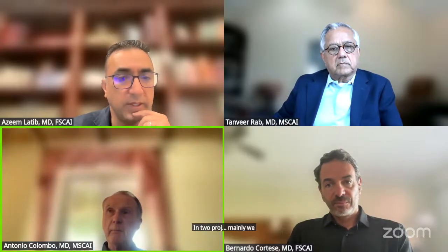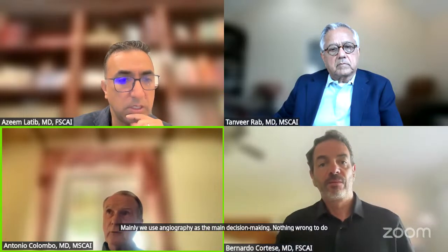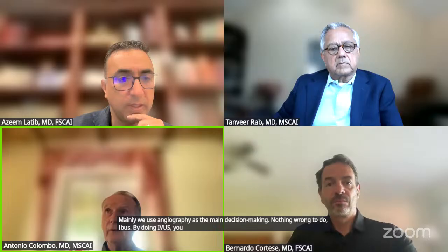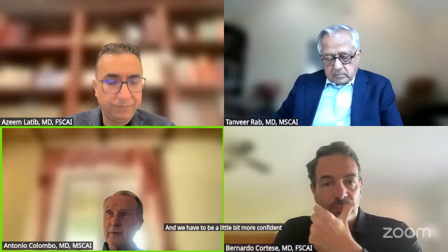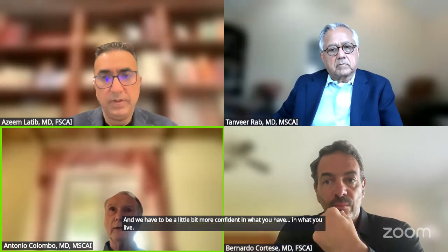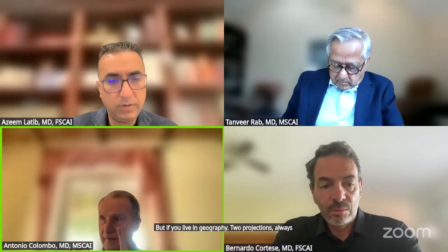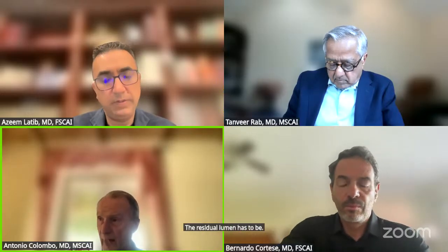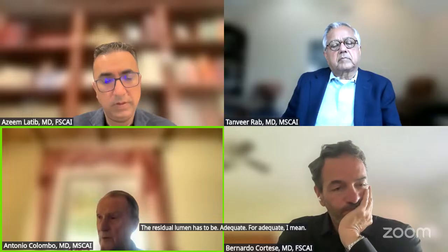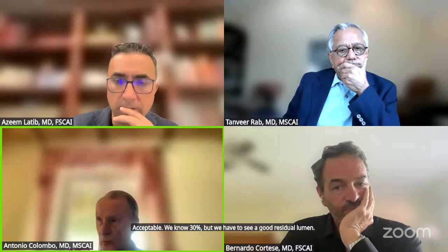In two projects, mainly we use angiography as the main decision making. Nothing wrong to do IVUS. By doing IVUS, you learn and you get more data, and you have to be a little bit more confident in what you leave. But if you rely on angiography, two projections, always two projections. The residual lumen has to be adequate. By adequate, I mean acceptable. We know 30%, but we have to see a good residual lumen in two projections.